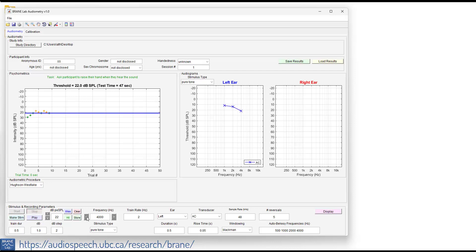And so that was 4000. Then we go back to our 500 Hz testing. Now you can do more frequencies, but for research purposes, we were testing 500, 1000 Hz, 2000 Hz, and 4000 Hz. So we'll go back to our 500 Hz. Make that stimulus. And again, start at 30. Go ahead and click start.